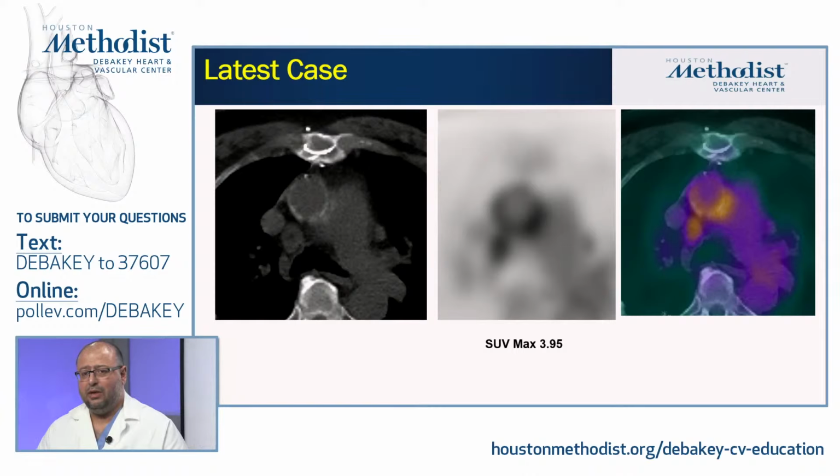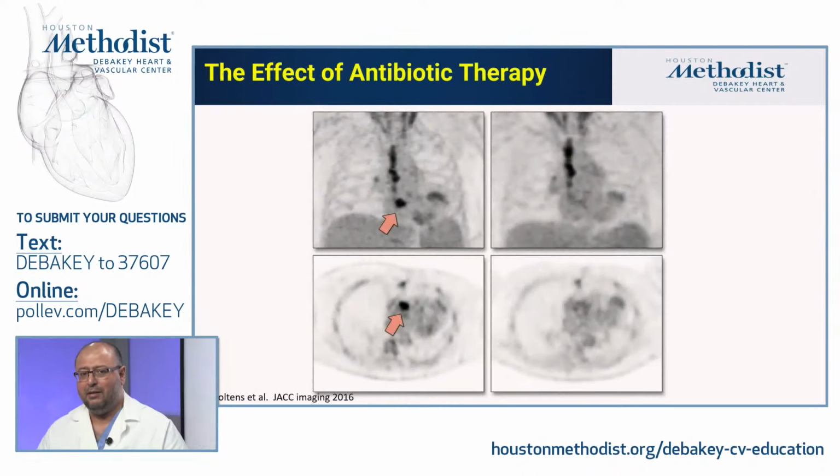Another case that we struggle with is the effect of antibiotic therapy. Sometimes patients come to us, but they already had 2 or 3 weeks of antibiotics, where the inflammatory response, or the white blood cell response to these infections, has significantly decreased. And you can see that some of these have much less uptake at that time, and that's why it's very important to keep that in mind when you are interpreting it. So you're not going to have the same intensity of FDG uptake when you are looking at these.